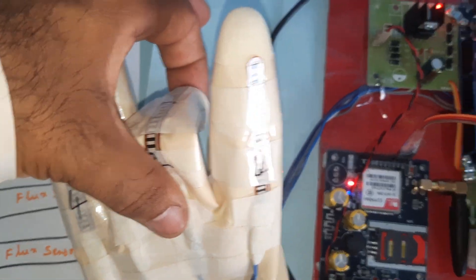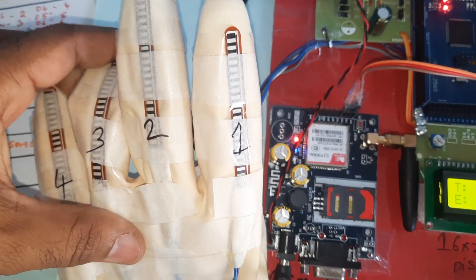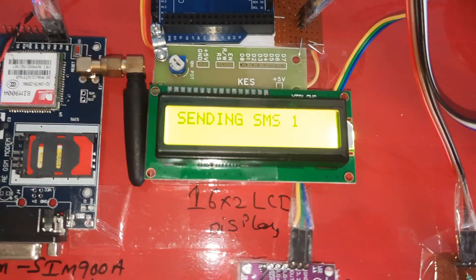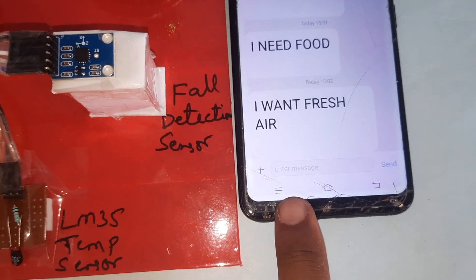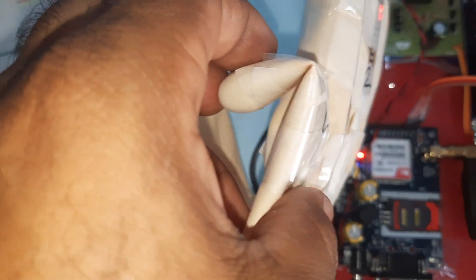Second finger bending — the system sends an SMS alert saying 'food.' Third finger bending — the system sends an SMS alert saying 'fresh air.' Now fourth finger bending.